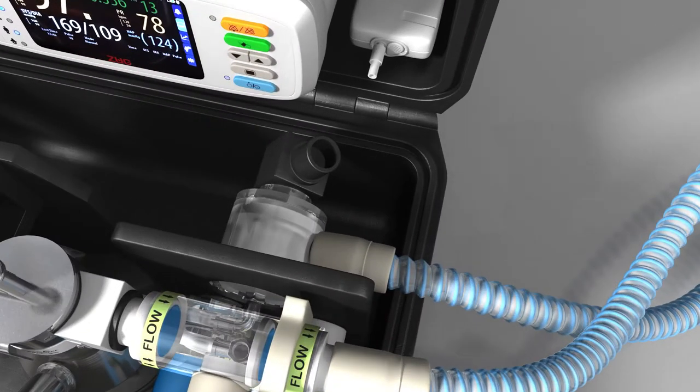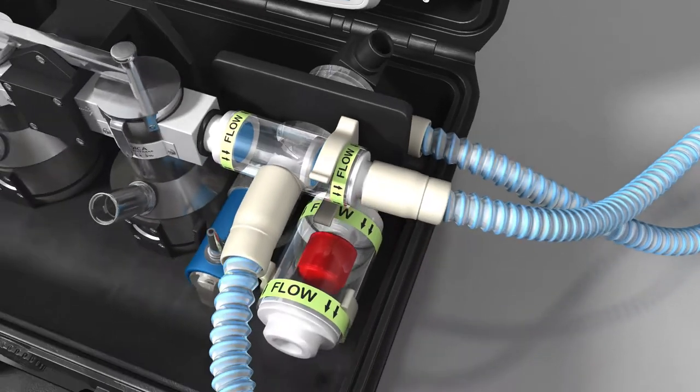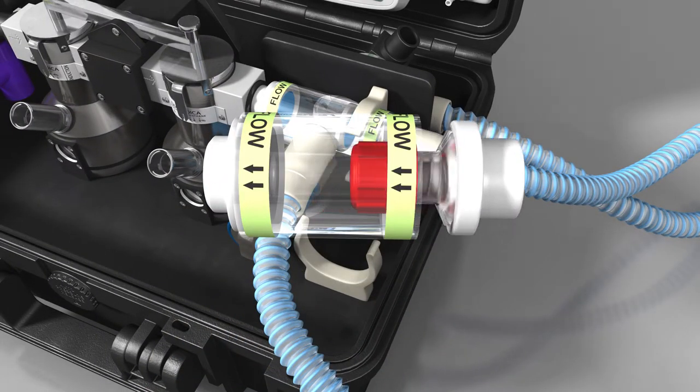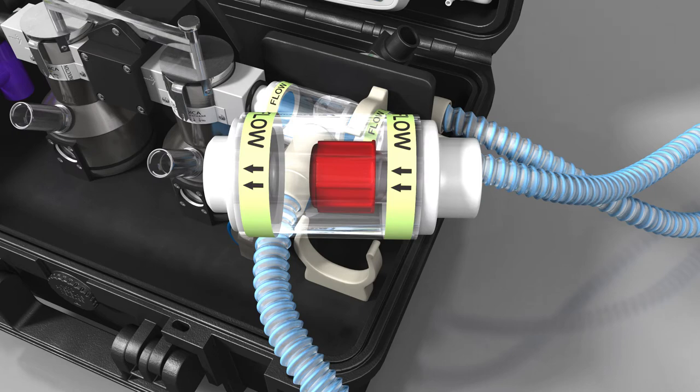PEEP and scavenging can be applied on the 30mm outlet of the expiratory valve if required. To adjust the PEEP valve, remove the valve by pulling it away from the clear case. Turn the red cap clockwise to increase pressure and anticlockwise to reduce pressure. The PEEP valve pressures range from 0 to 20cm of water pressure.